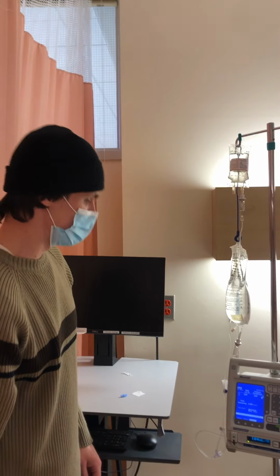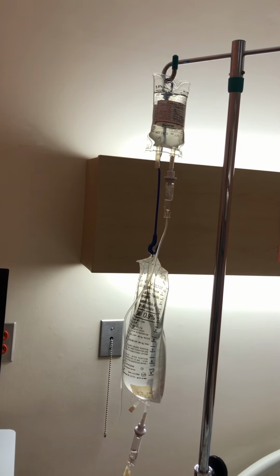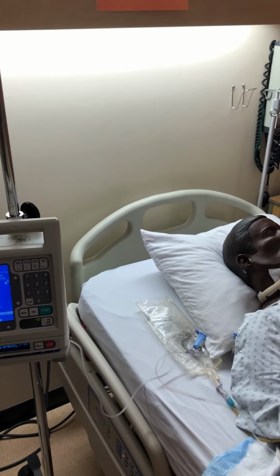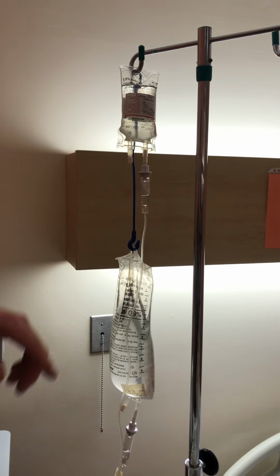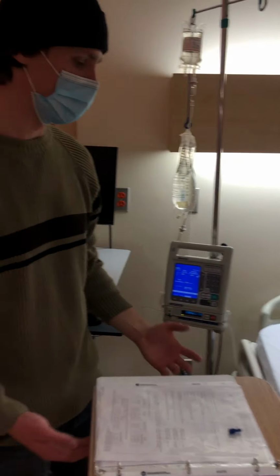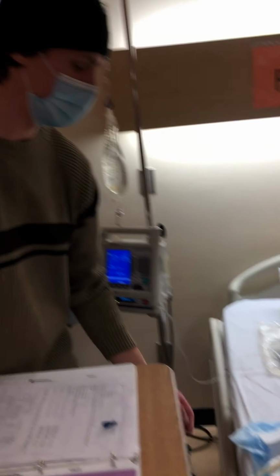So now it's started, so now I'm going to just make sure there's a few drips. Actually, unclamp this, I forgot to unclamp this, and make sure there's no clamps or occlusions downstream. And I keep in mind I watch for the 3 drips here, and there is. So perfect. And now I ask the patient if they have any questions. They don't. I'm just going to assess the IV site right away, and there's no signs of irritation already.